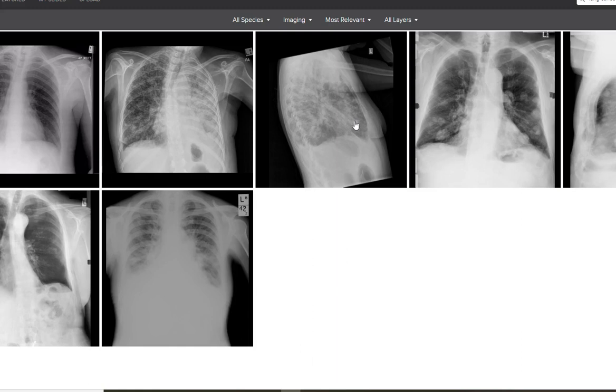I don't know that anybody's proven that, but given that the literature doesn't support any one kind of chest physio over another, always err on the side of caution, so I wouldn't use those techniques in somebody who had anything on their chest X-ray that maybe looked a bit like that. I would just err on the side of caution.